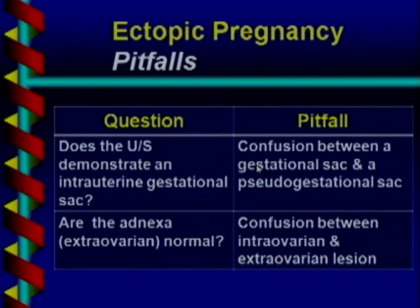So I've gone over the basic rules of diagnosing ectopic pregnancy. Life isn't always so easy that we can apply basic rules. There are some problems or pitfalls that one can run into in diagnosing ectopic pregnancy.